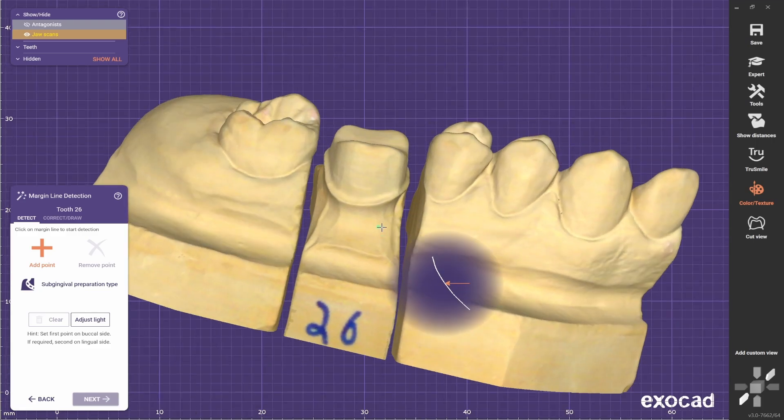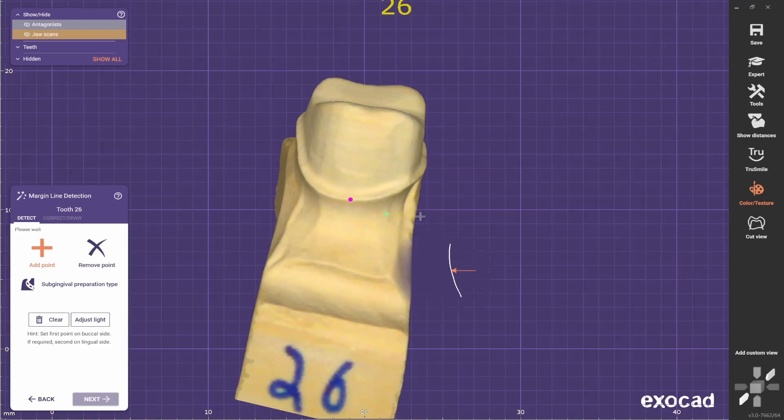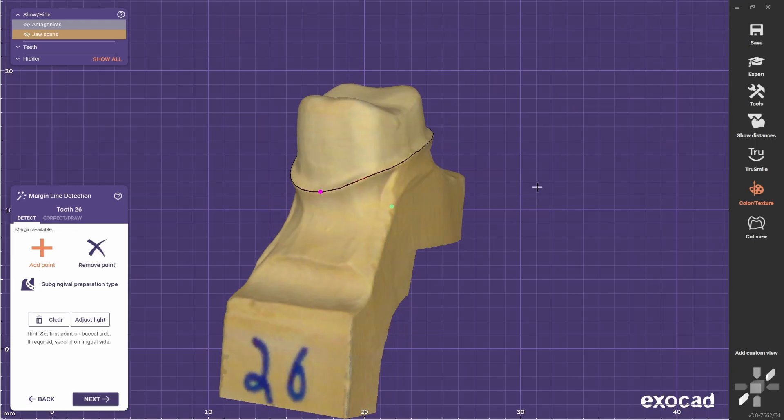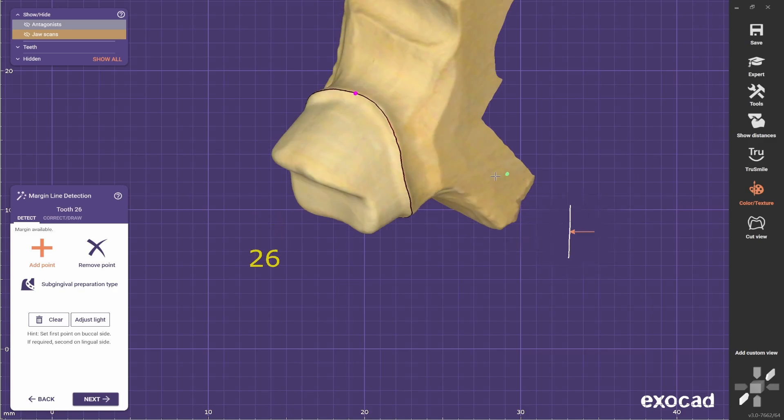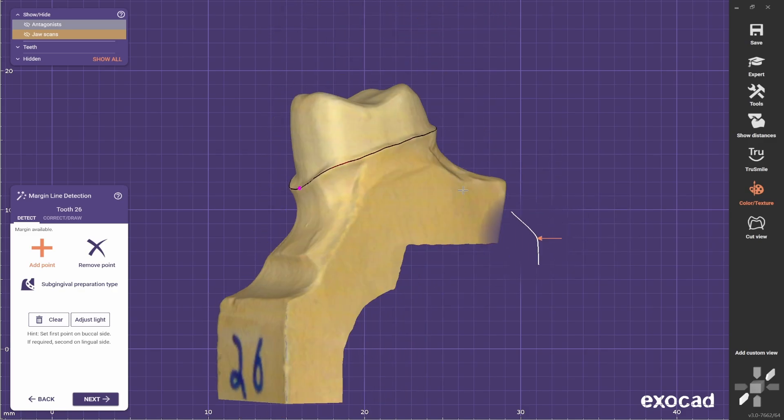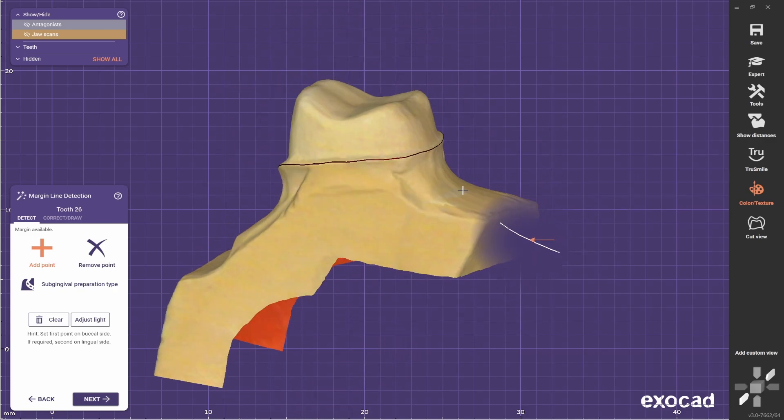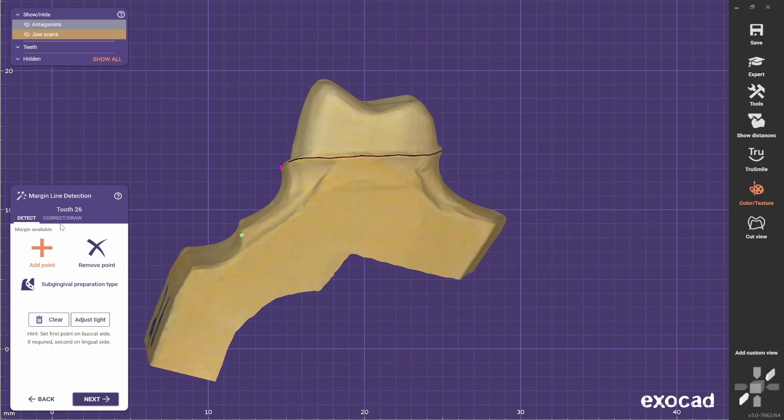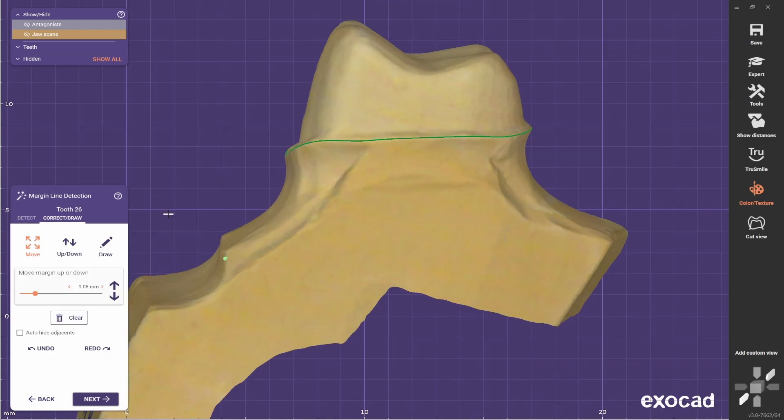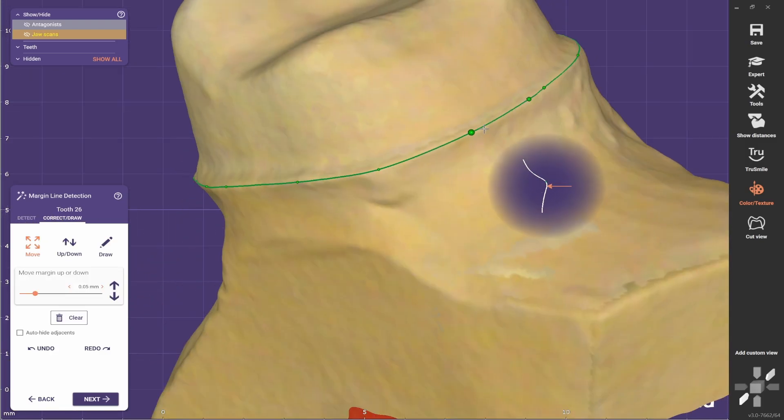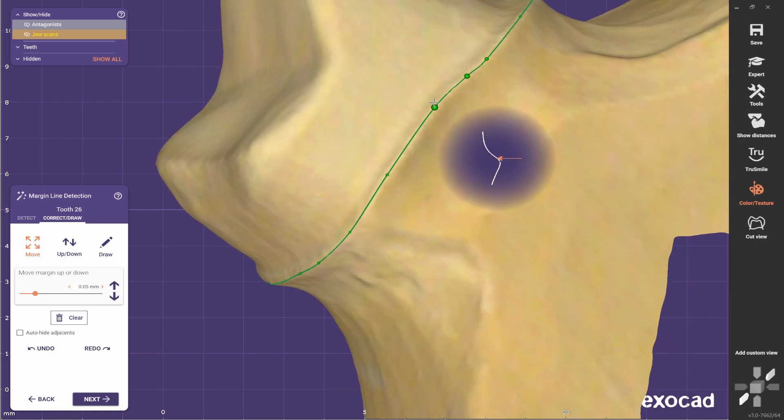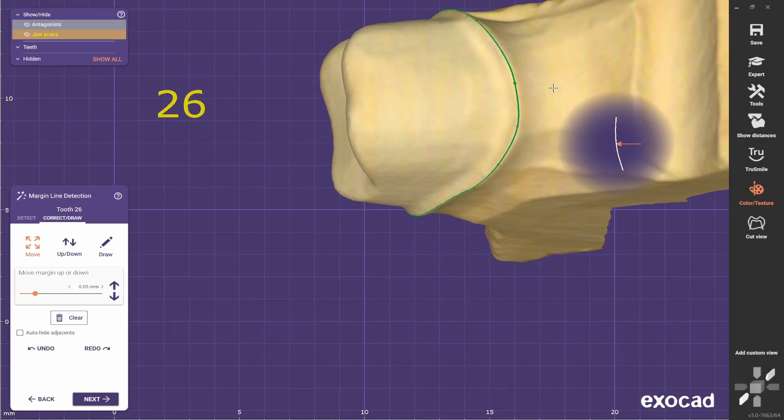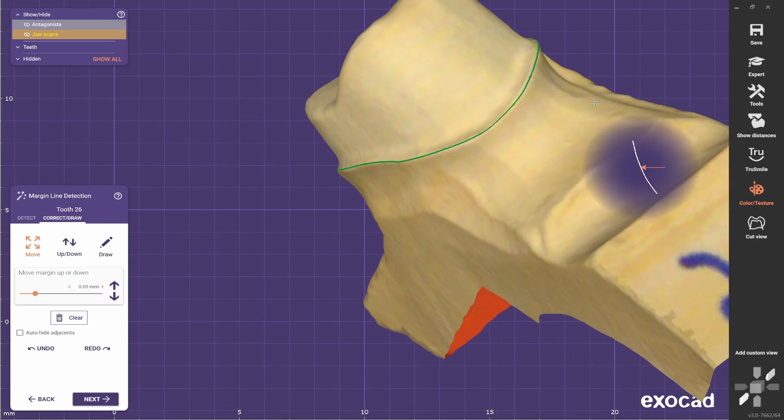Now select the margin. Just press a point in the margin and the software will discover the rest of the margin for you. If you want to adjust it, come correct and draw and select the point. Make sure everything is on the right spot, and when you are happy with it, go next.